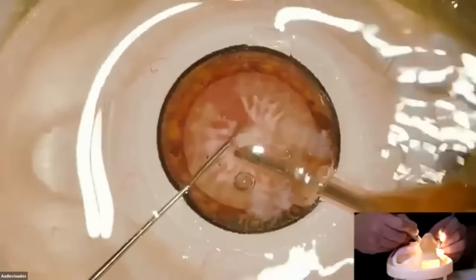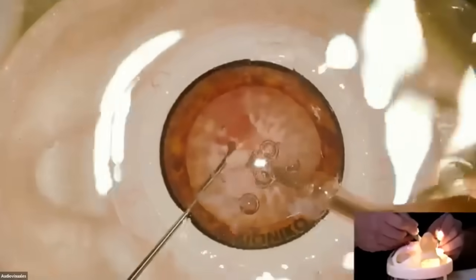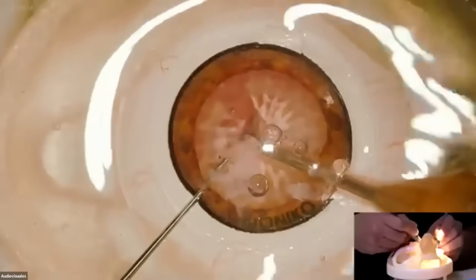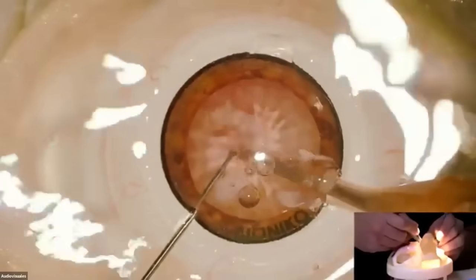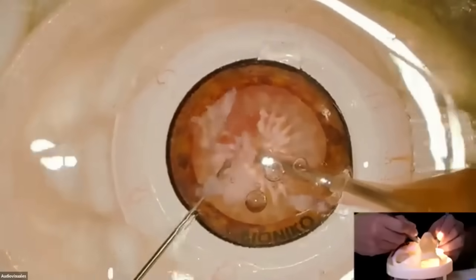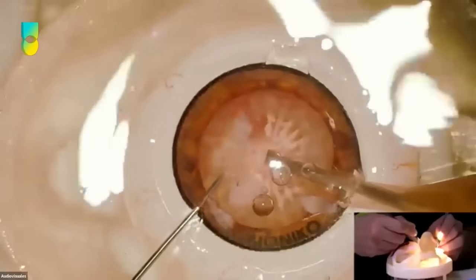There you go. I want you to occlude, and it's a very hard cataract. And this is good because he's facing a very hard case since the beginning. Look at that. Okay. But I want you to occlude the tip. Okay. And then when you occlude the tip, then you're going to deliver position 3. Ashley, tell me your thoughts about when you're doing emulsification of the nucleus.